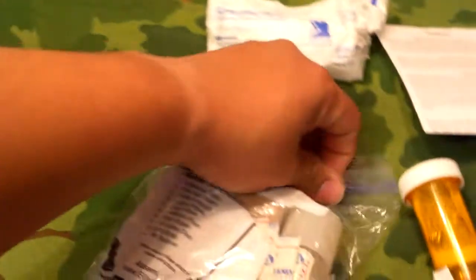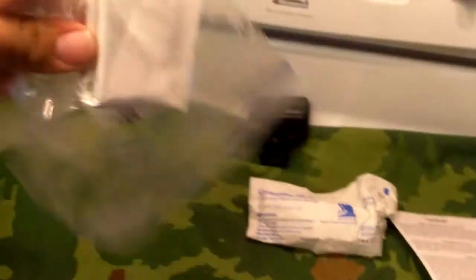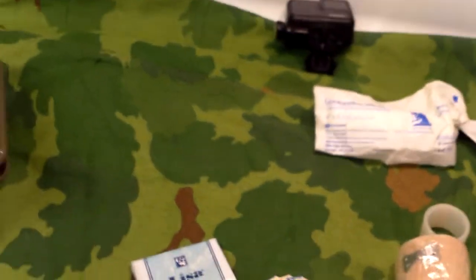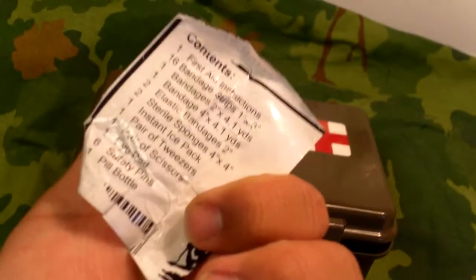So on to the contents. This is the Elite First Aid kit, so it's technically not USGI — it has a USGI container, but it's not exactly how the original ones looked. I'm going to do my best to go through everything. It's been a while since I've gone through this, so this makes for a good video. After the video I'm definitely going to have to figure out what to keep and what should be thrown out.